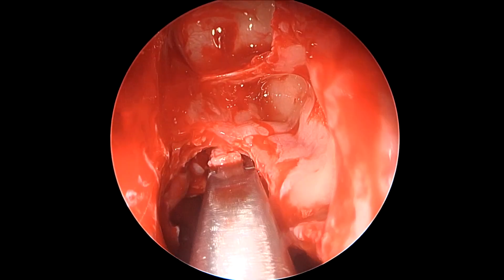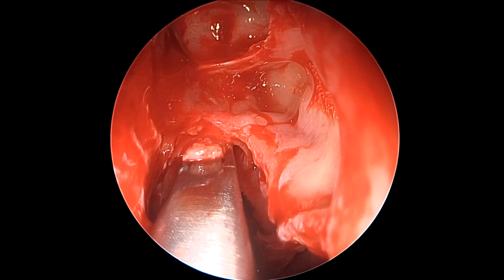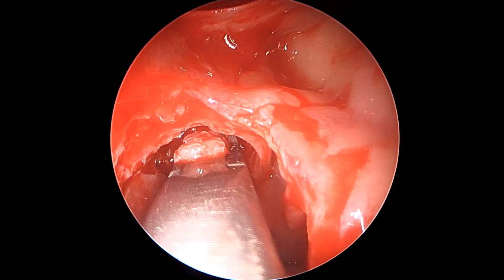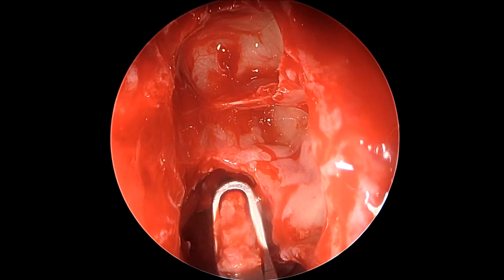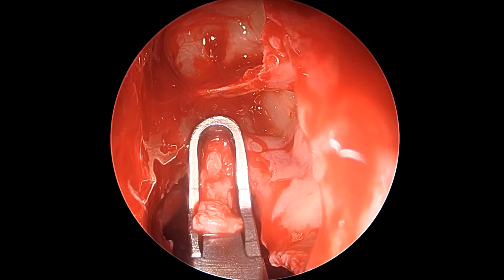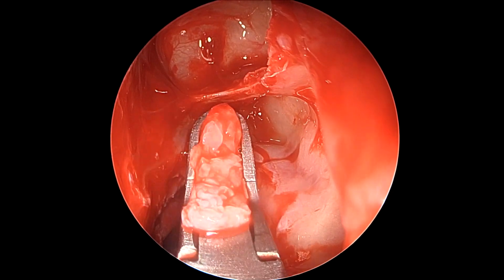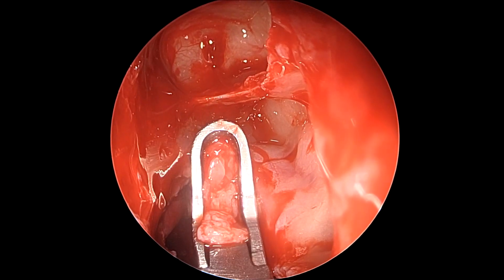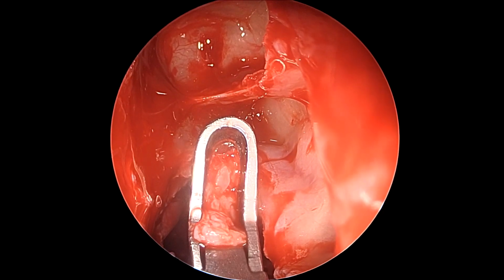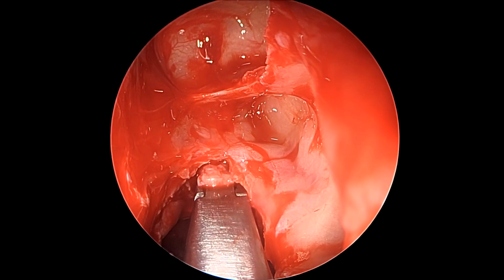So this is a much better way of doing it rather than using curettes or Blakesley forceps, because all of these exert force. Curettes can sometimes slip and cause CSF leaks. And Blakesley forceps are also not to be used because they pull the mucosa, they create bare bone, which heals by granulation tissue and scarring, and they also lead to avulsion of these septations, which have direct attachment to the skull base.